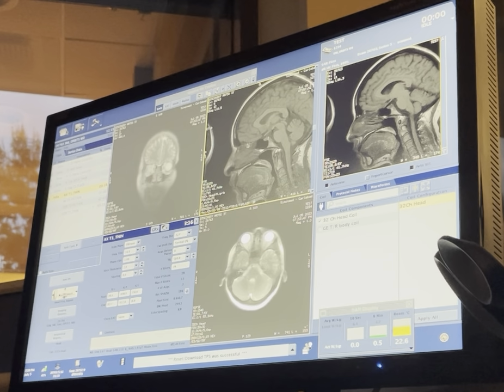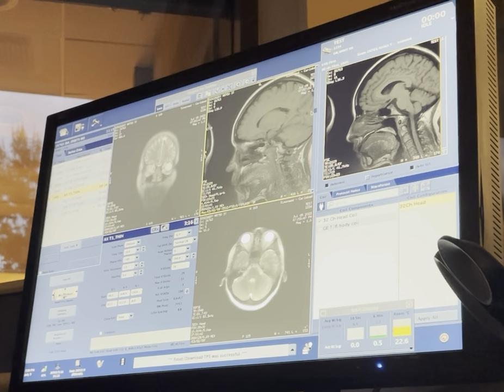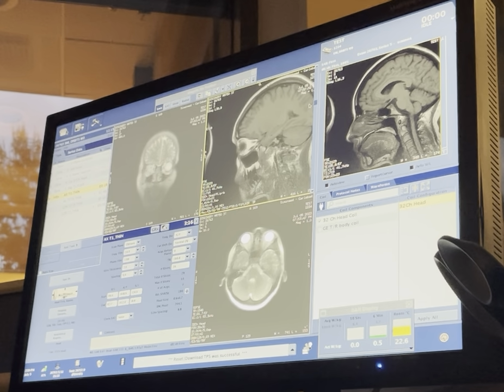Do I have to look for the eyeballs first? If you want. Yeah, I'd angle with it. So let's find a good slice of the optic nerve. Find one eyeball for now. There you go. That's one. So go back. That's the slice right there. See that? Okay, so now let's go on our axial plane because we're doing an axial.